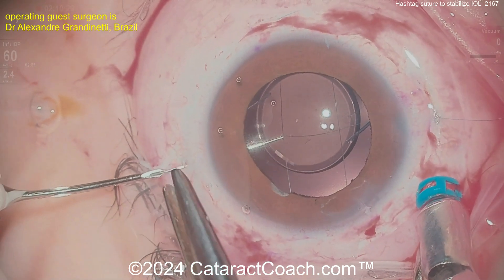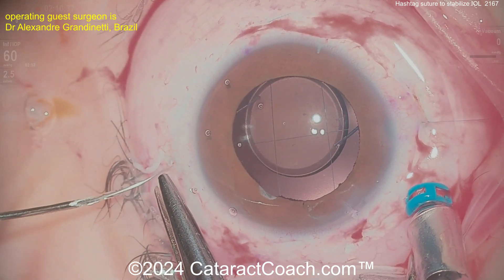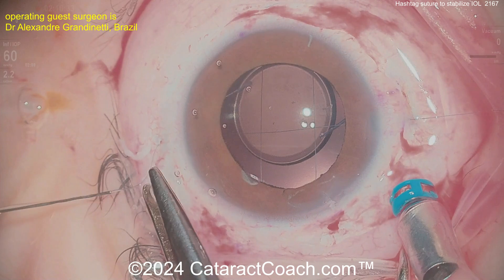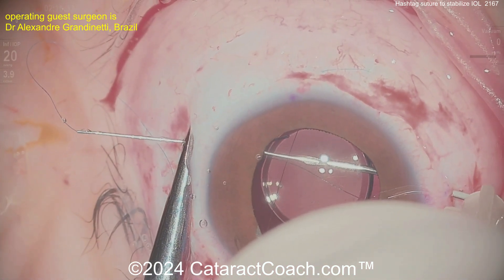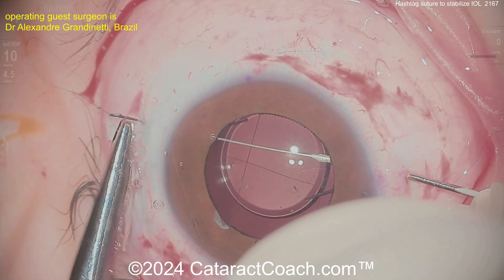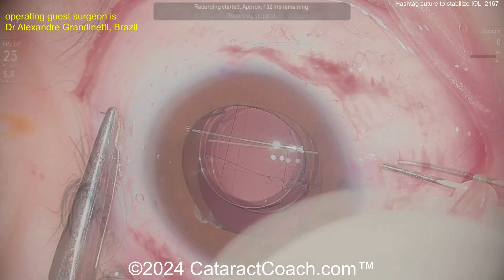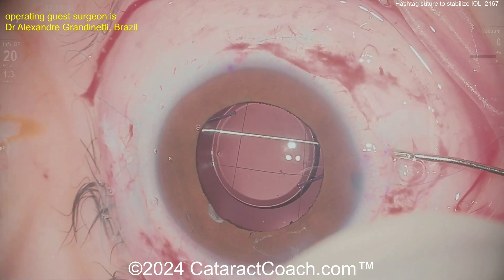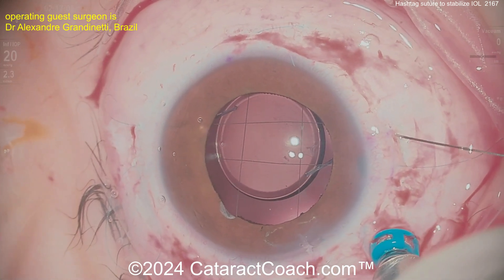Doing the same thing coming across here — you can see bringing that long suture out, that 10-0 polypropylene, and bringing that out here, then making a U-turn and passing it back the other way. Now these knots are going to be tied and then buried and rotated inside the eye, and that should really give a good result to hold this lens in position for the patient.